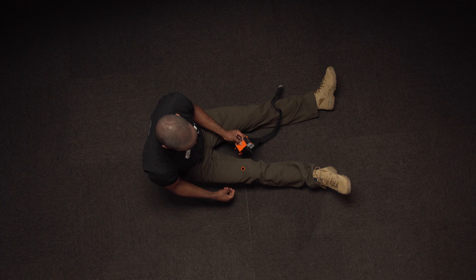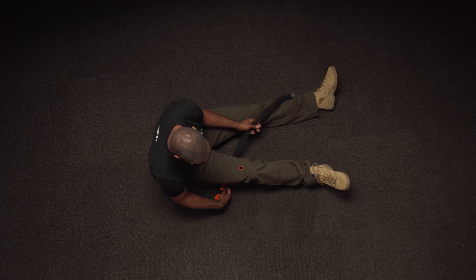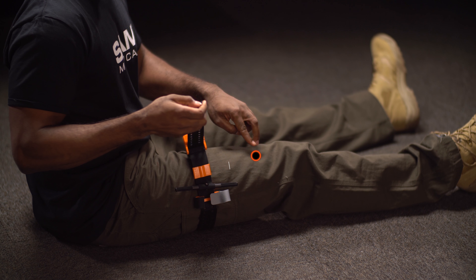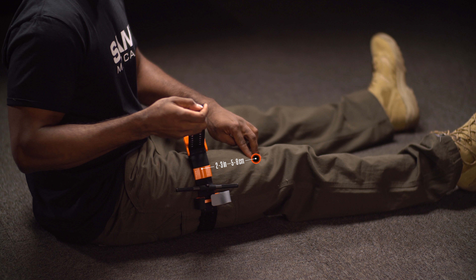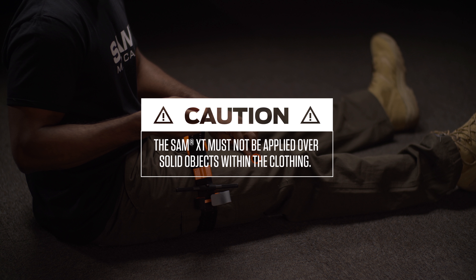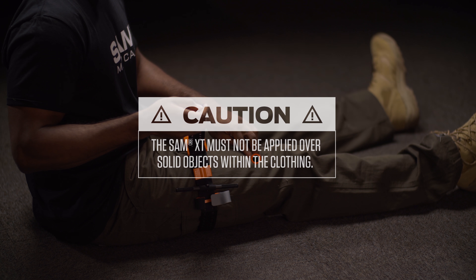To begin, locate the site of the injury. When self-applying, insert the precision tab of the strap through the opening of the True Force buckle and slide the loop about 2-3 inches above the wound. If applied over a garment, be sure to remove any solid objects on or inside the clothing.